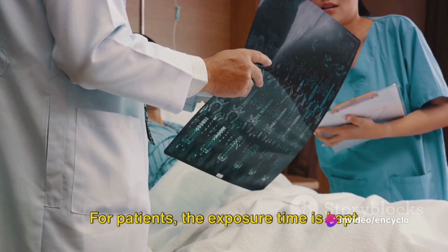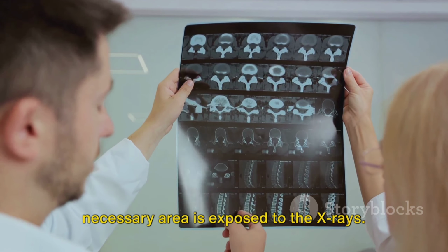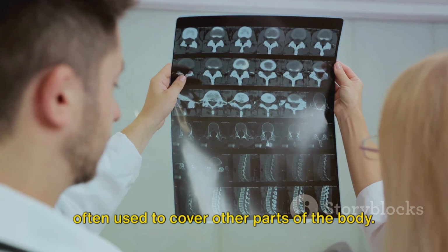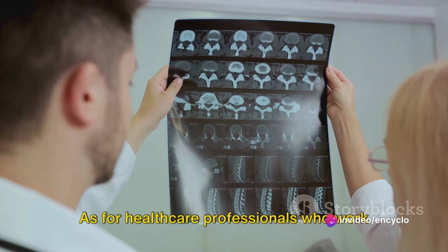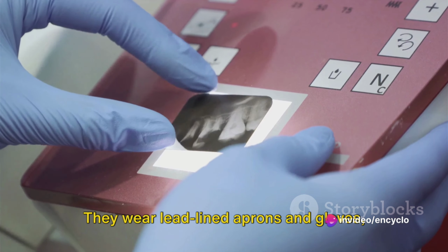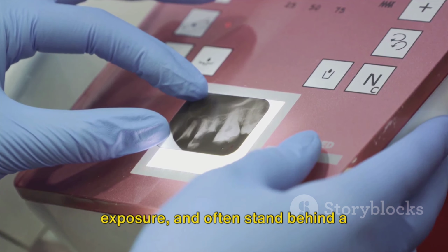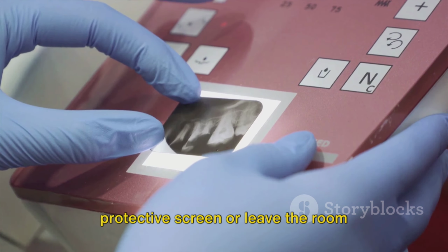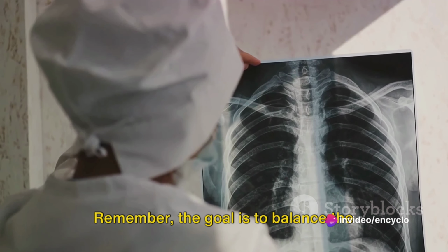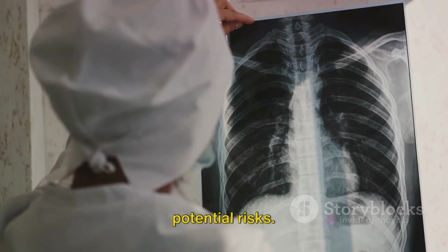For patients, the exposure time is kept as short as possible, and only the necessary area is exposed to the X-rays. Additionally, lead aprons or shields are often used to cover other parts of the body. As for healthcare professionals who work with X-rays, they also take precautions. They wear lead-lined aprons and gloves, use dosimeters to monitor their radiation exposure, and often stand behind a protective screen or leave the room entirely when an X-ray is taken. Remember, the goal is to balance the immense benefits of X-rays with the potential risks.